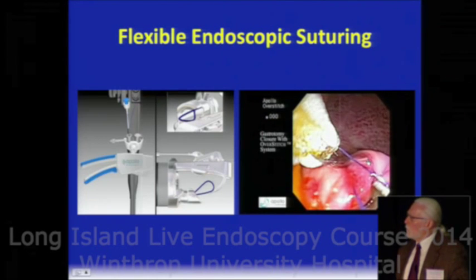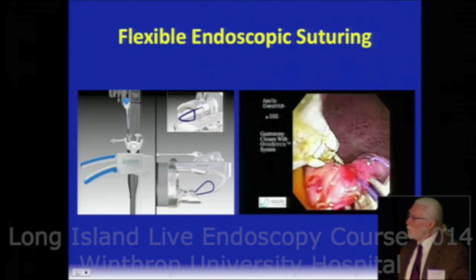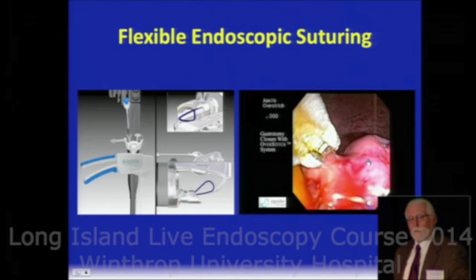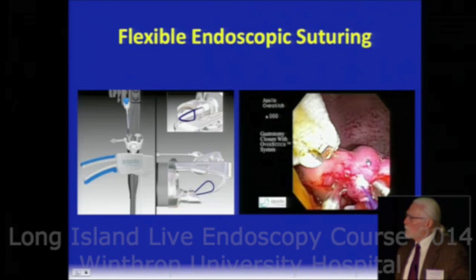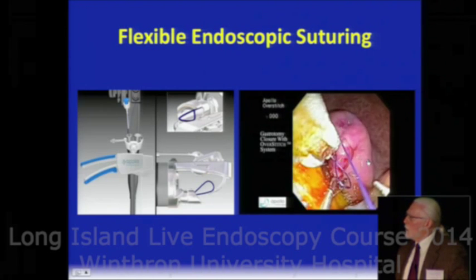The other observation I want you to make is the endoscopic view that you see here. It's really not impaired. The endoscopist can see very nicely what's being done. You'll see it today in live cases.